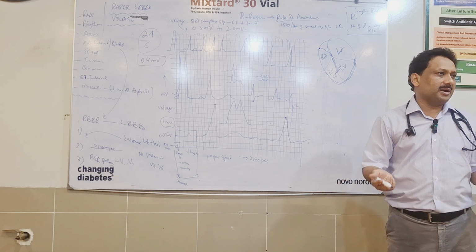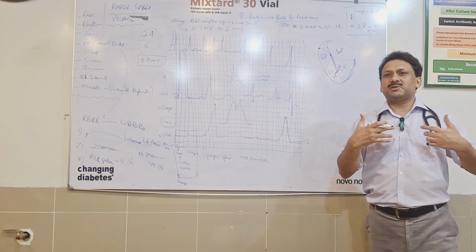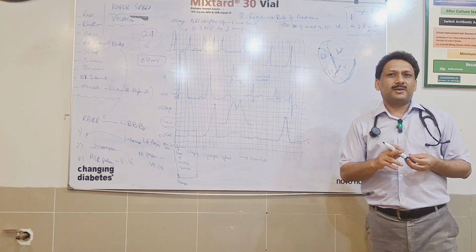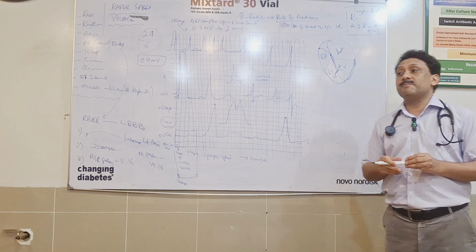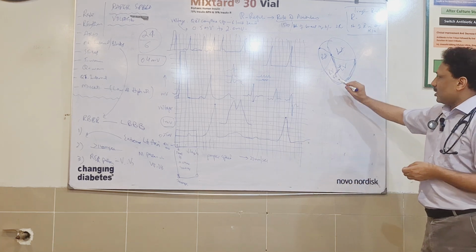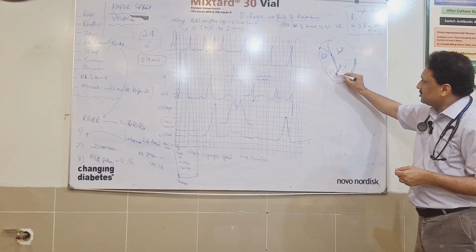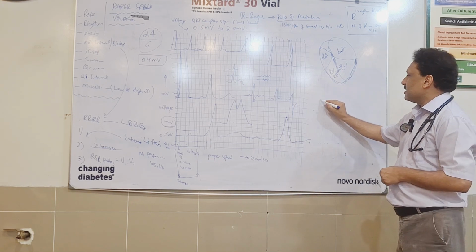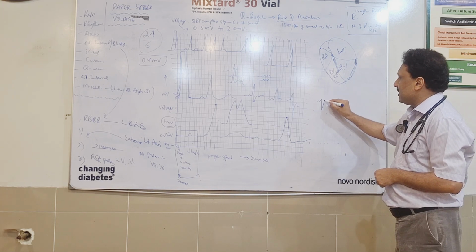Same way it can affect the conduction system, or if a person gets too old, his conduction system will be fibrosed. So in those situations, as the conduction system won't be working well, a person may suffer from some block. So talking about right bundle branch block, we just block this thing. What will happen? I draw here normal lead V1 in a person. This is a normal lead V1 in a person.